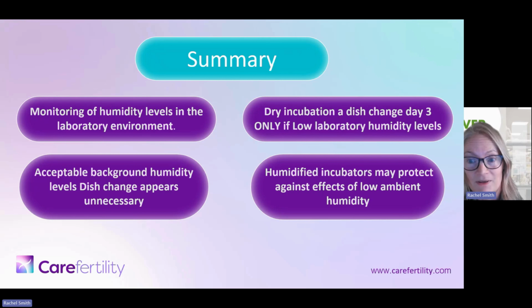But if your humidity levels drop to a low level, then you would benefit from instigating a day 3 dish change. And what we do know from all of these experiments is that humidified incubators do protect against some of these variations in evaporation rates by providing a humid environment. So if the humidity does drop, there is a protective effect of utilizing a humidified incubator environment.